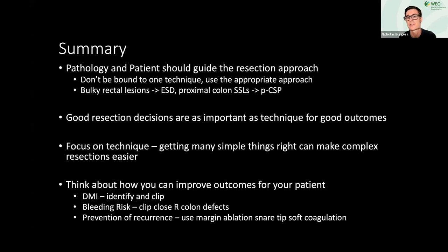Good resection decisions are as important as technique for good outcomes. So it's important to understand what you're doing and why you're doing it. But also focusing on technique is important. Getting the simple things right will make complex resections much easier. And think about how you can improve outcomes for your patients.